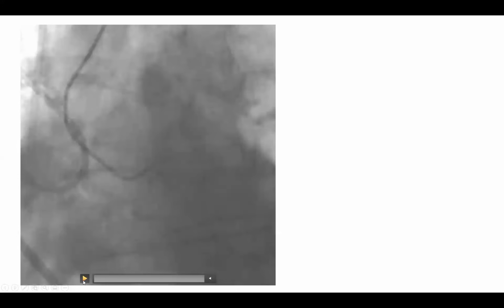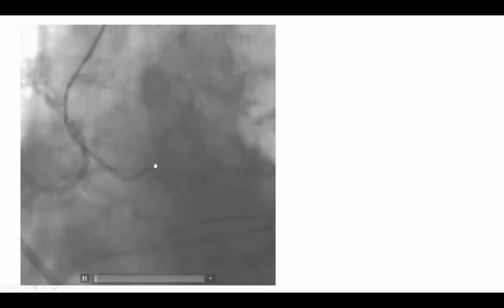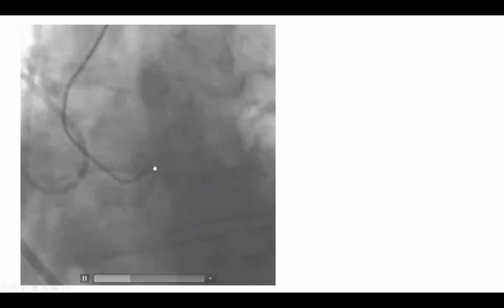This here is a simple picture I want you to recognize. So here we have a catheter, we're giving a puff. When we give that gentle puff, I want you to recognize, where is this catheter? Is it in the right or is it in the left cusp? It's simple. Whenever you see this, you see that ridge here. You see that ridge here? This is the right coronary cusp. You're still in the right coronary cusp. You're not seeing the left coronary yet.